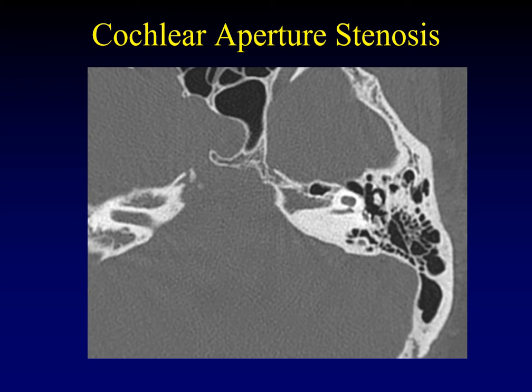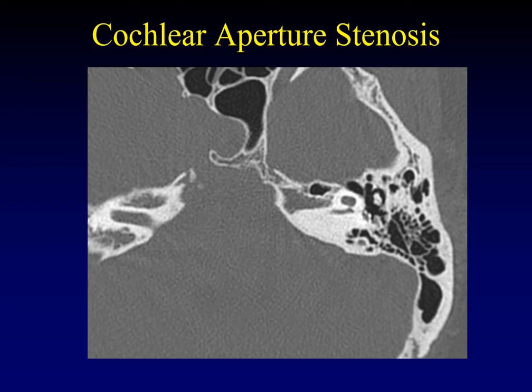The cochlear aperture is the opening between the internal auditory canal and the modiolus of the cochlea. The cochlear nerve goes through the cochlear aperture and then spirals up the modiolus in the center of the cochlea. The cochlear aperture can be too small or too large — I encourage you to look at it on all your temporal bone imaging until you get a sense of the normal size; it's much easier to see on CT than MRI. Here is a situation where the cochlear aperture is way too small — very small cochlear aperture — usually seen in conjunction with cochlear nerve atresia.